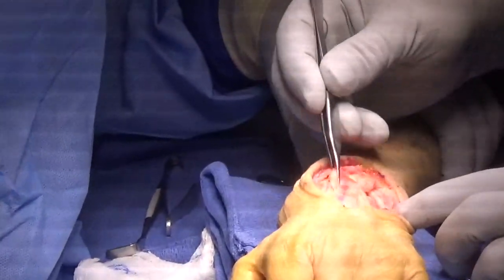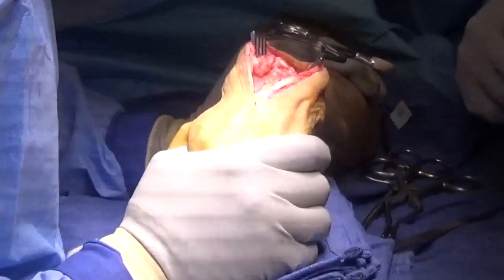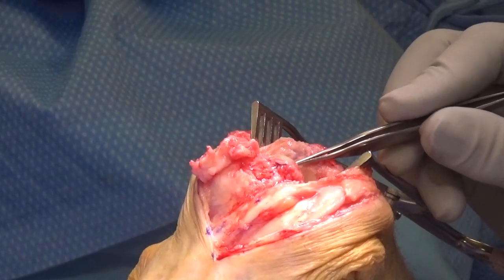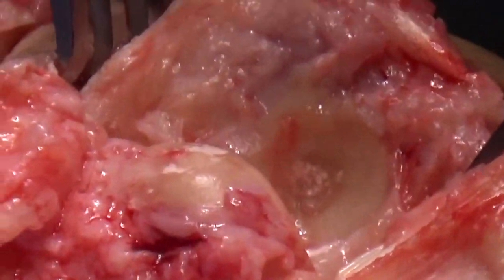Here we can see the fourth compartment, the fifth compartment tendons, and the second compartment. The wrist is flexed. There's bare bone grade 4 degenerative change to the head of the capitate as well as to the lunate facet of the distal radius.